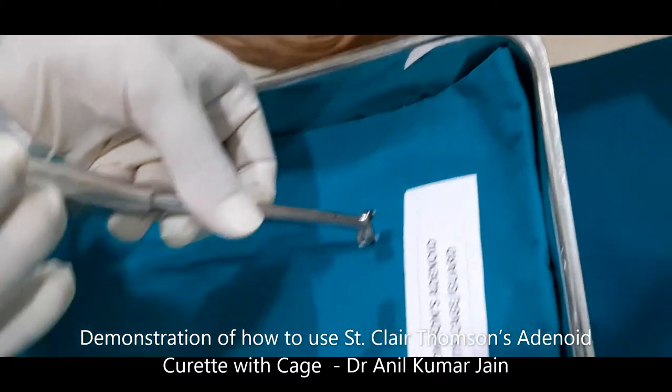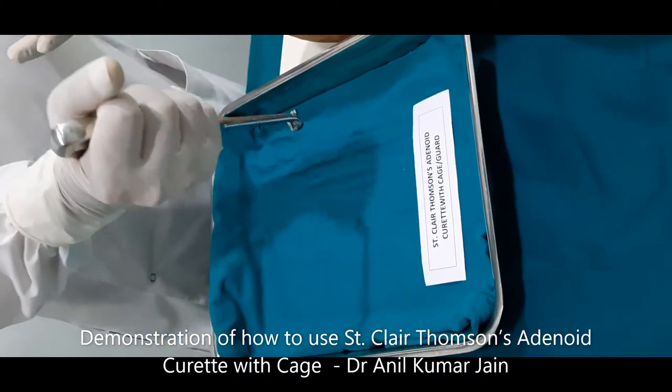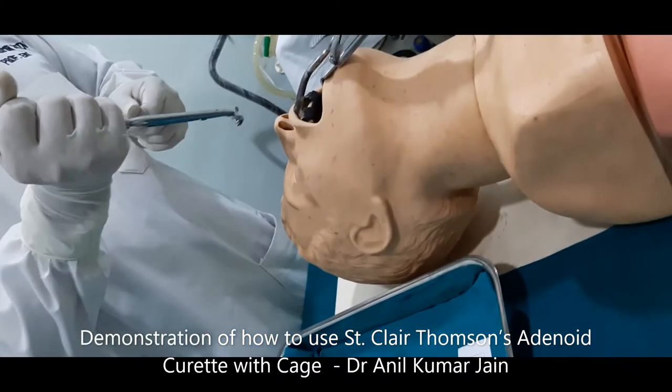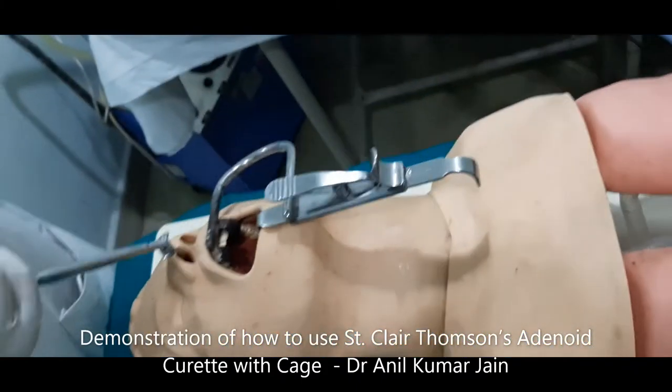Now hold this instrument like a dagger, and this is to be used in a patient who is in supine position. Please remember a few things.